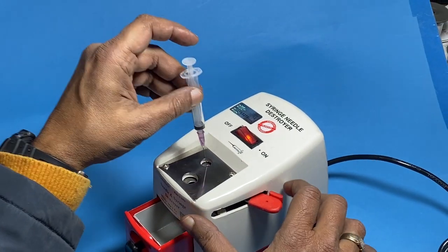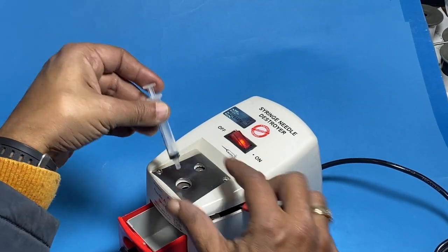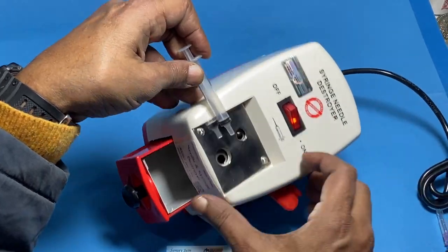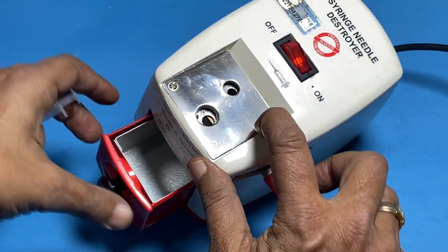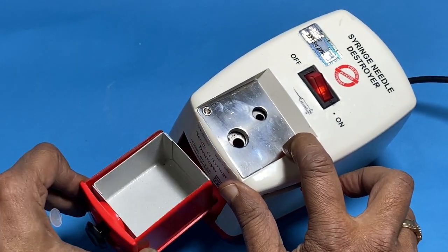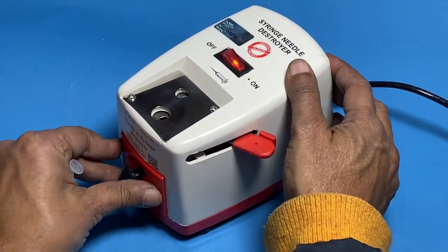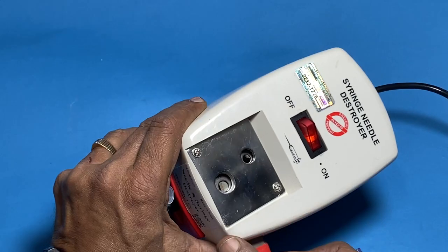The top will go and then you have to break this, putting the second part in — there is a cutter. Just to show you the close-up: there is a cutter, you will put it and it cuts the needle. When it is cut it comes to the chamber — inside is a very strong heavy heater so that this can work.